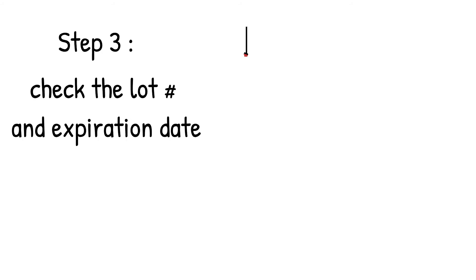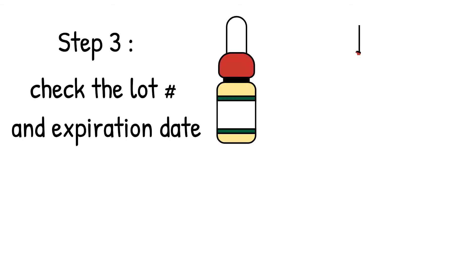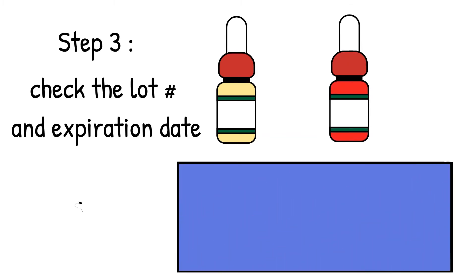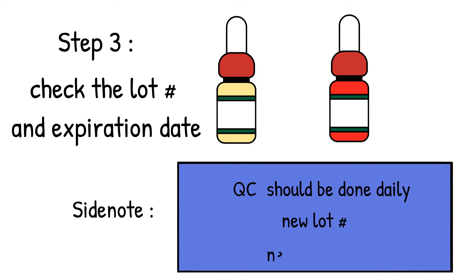Step 3: Check that you are using the correct lot number and that the reagents are not expired. The reagents are to be QC'd daily and with each new lot number and new shipment. Expired or defective reagents can give you false test results. For instance, expired reagents lose their strength and can give you false negatives when the reactivity is actually positive. These lead to wrong blood type determinations.